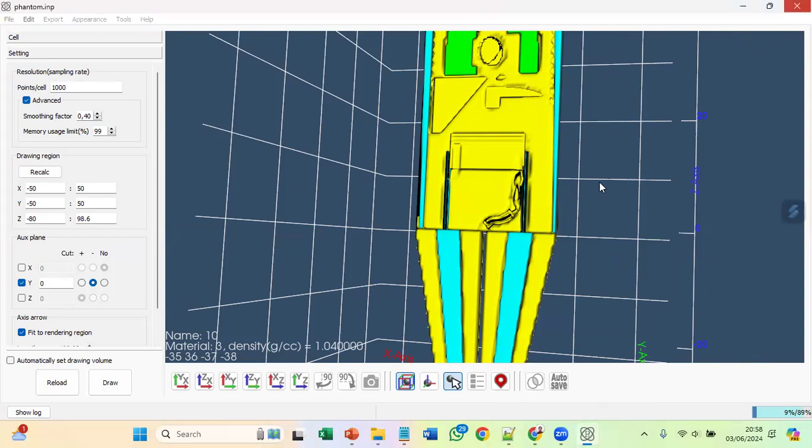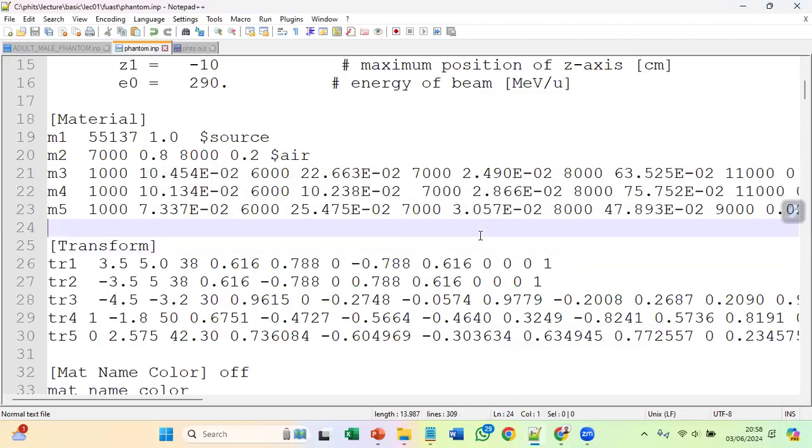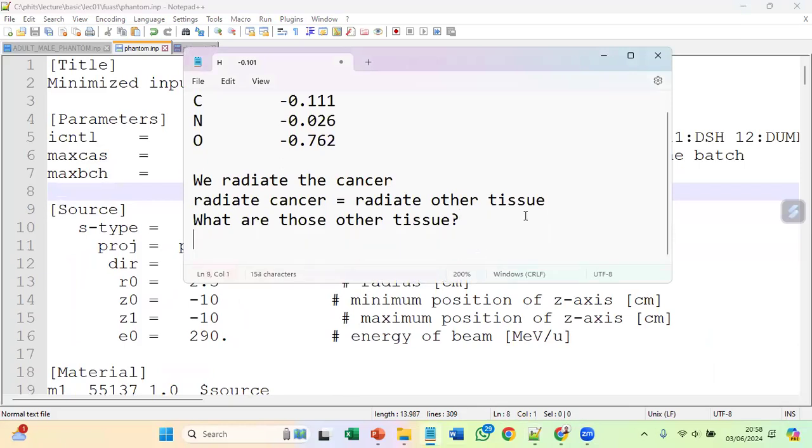So I think yes, pardon. Sir, so what should we do? Should we replace the location from lips to any other body part, or should we keep it? My suggestion is, I have two suggestions, right? What are those tissues?